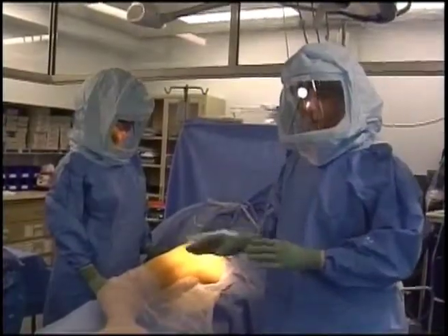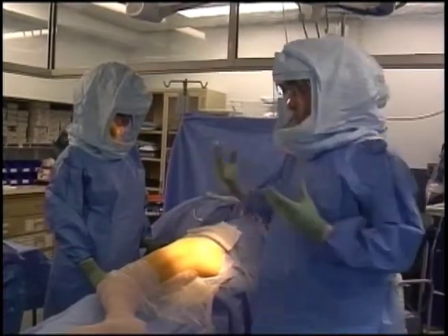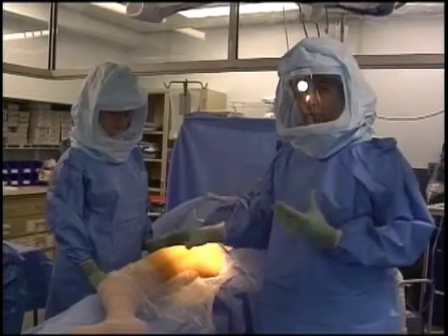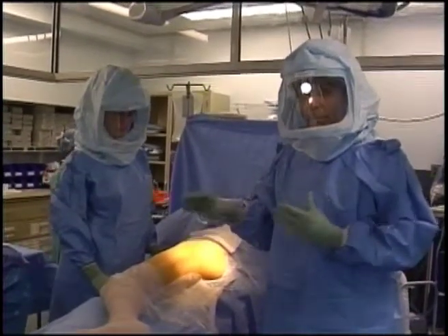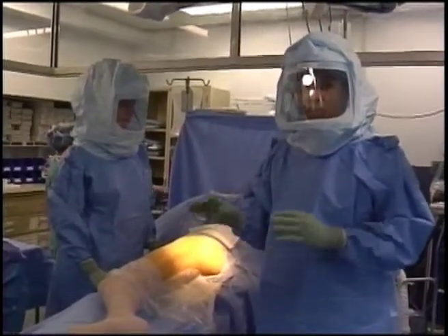We've sterilely prepared the patient's leg with an iodine and alcohol solution and sterilely draped the patient. The reason we're wearing gowns that look like astronaut suits is infection protection — keeping us as far separated from the patient as possible. Much of what you see today is aimed not only at performing a precise hip replacement but also at preventing complications such as infection.